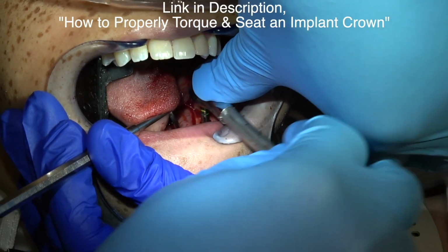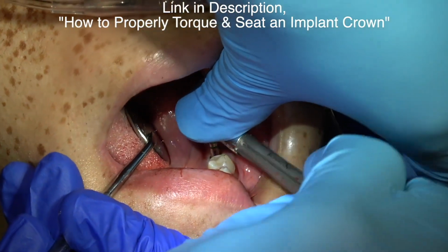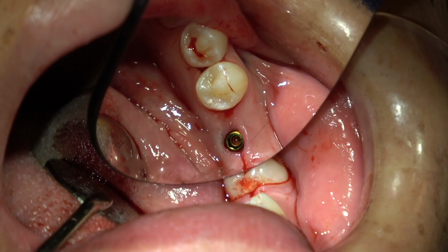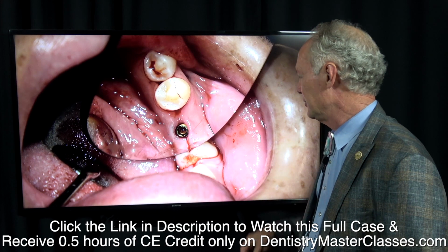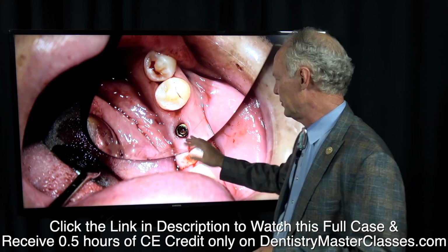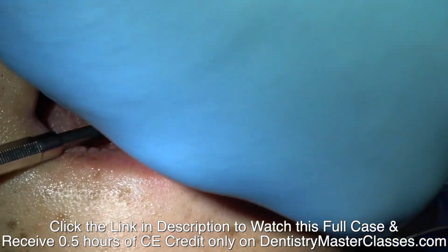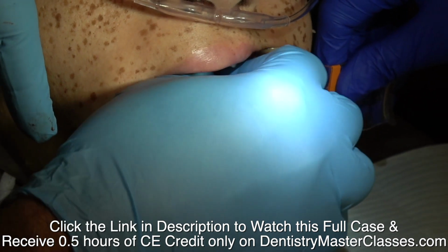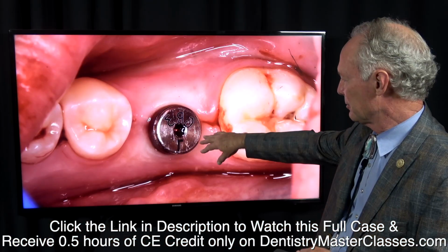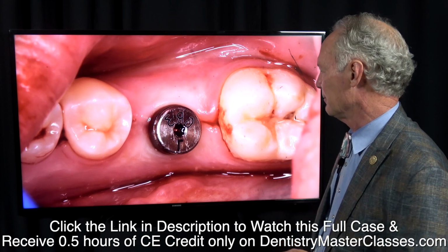Okay, so I'm screwing this 12 millimeter implant into place, and I want to torque it to at least 35 Newton centimeters. Now, I'd like the coronal part of the implant to be just about at the alveolar crest. And remember, there's 2 millimeters of gingival tissue coronal to the crest of the implant. Then I'm going to place this longer healing cap. See, this is going to form an emergence profile around that longer healing cap. We take care of this cavity before we get to the end.